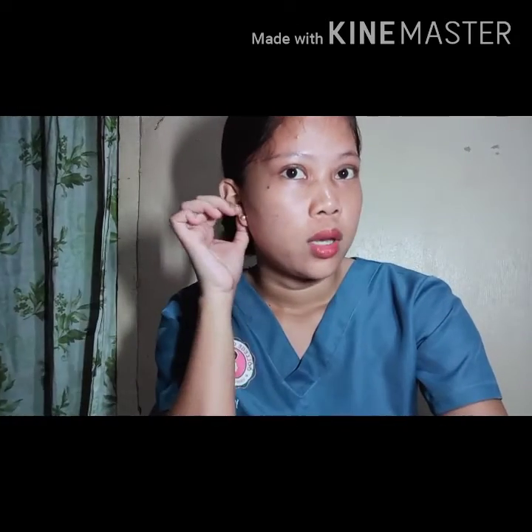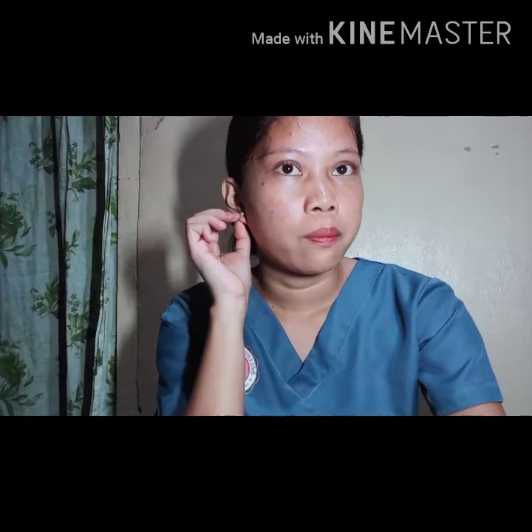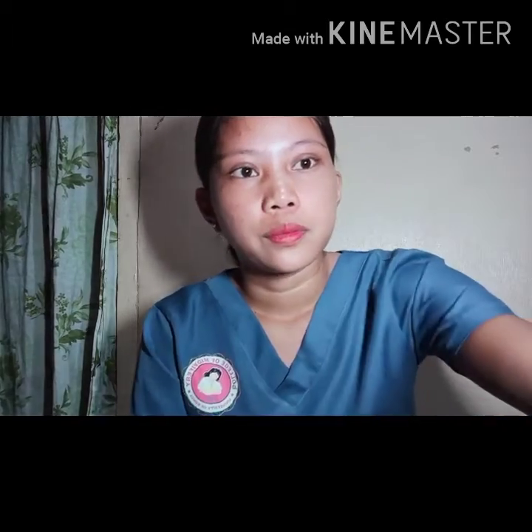Kaya kintay expired na siya. Nya, imuhang gigamit imbes tabangon imong pasyente gisamutan pa nimo. And our task is to help not to dili na to samutan og samot. So next is remove primary. So move the roller clamp about the drip chamber and close the clamp.